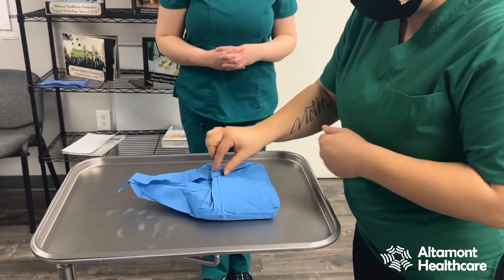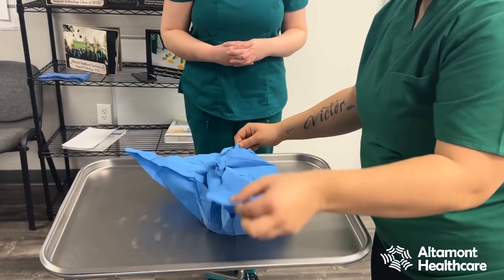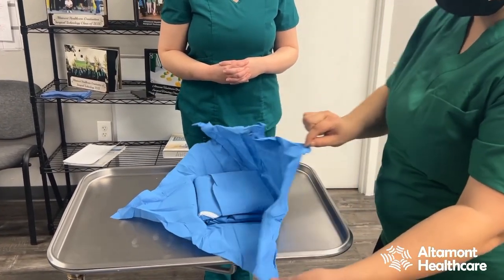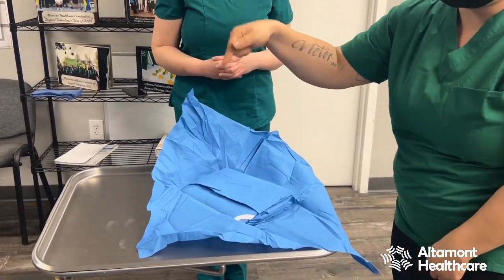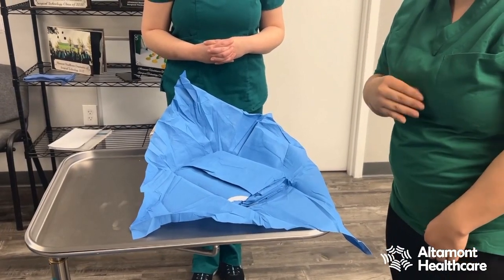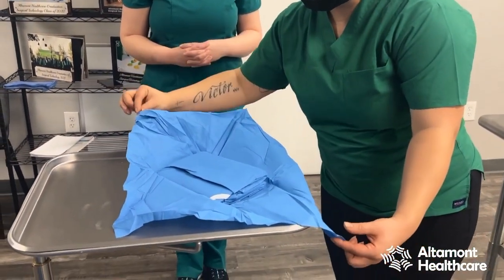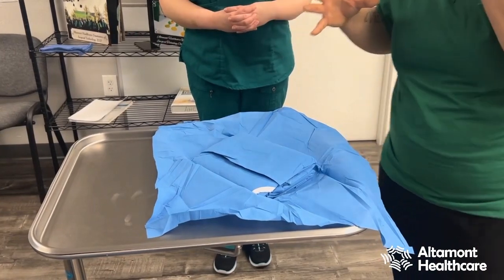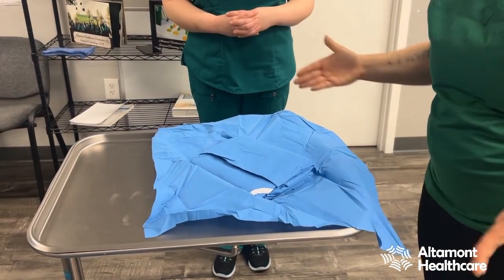The next two flaps are going to be side to side — to the right, to the left, and last but not least, towards me. Now you'll notice I'm using all fingers because I don't want this flap that I touched to hit the gown. If that were to happen, it would contaminate the entire gown and I would no longer be able to use it in a surgery. It's not an issue if you grab the corners; the issue is if this were to come back and touch the inside, which is sterile.